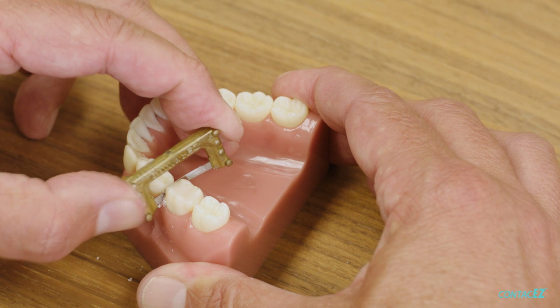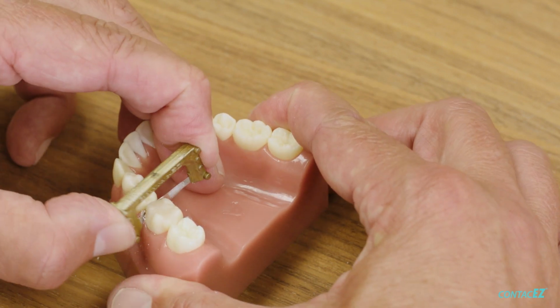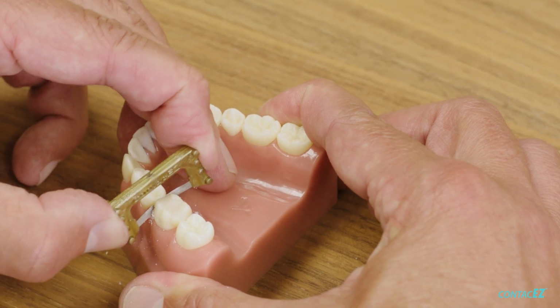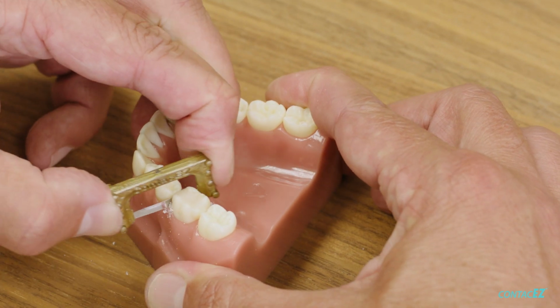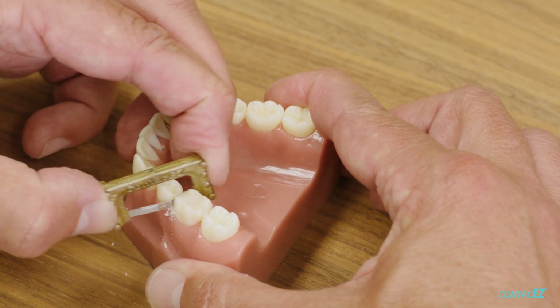And again, you want to use this strip. We're going to go all the way to the end of it like you see me using there, since that central portion doesn't have any abrasive on it. So we're definitely using this strip out towards the ends, whereas we usually have a tendency to use them more towards the middle. That's kind of the sweet spot.